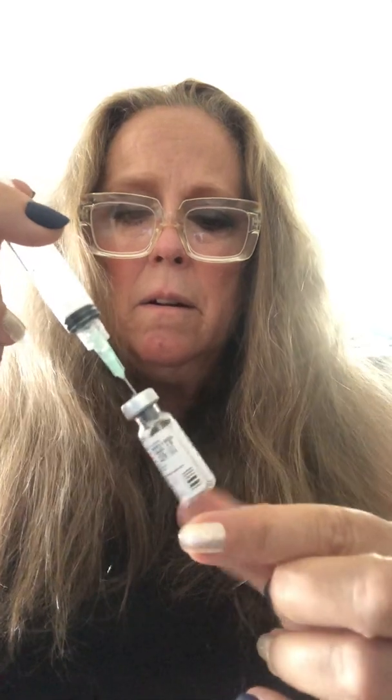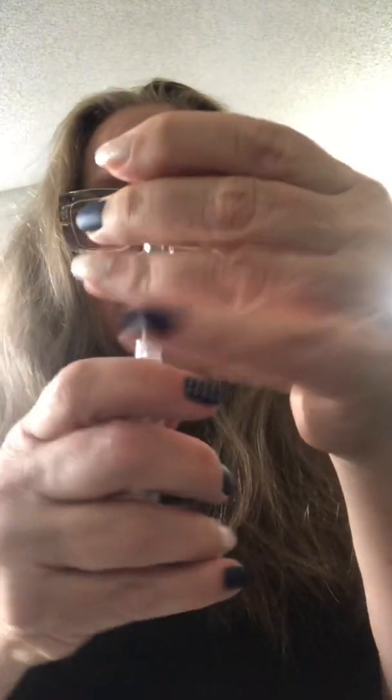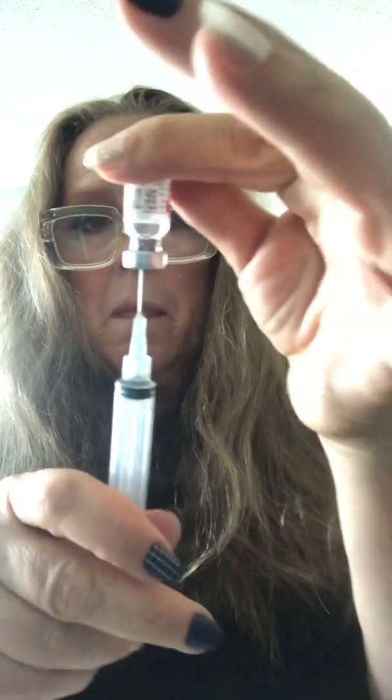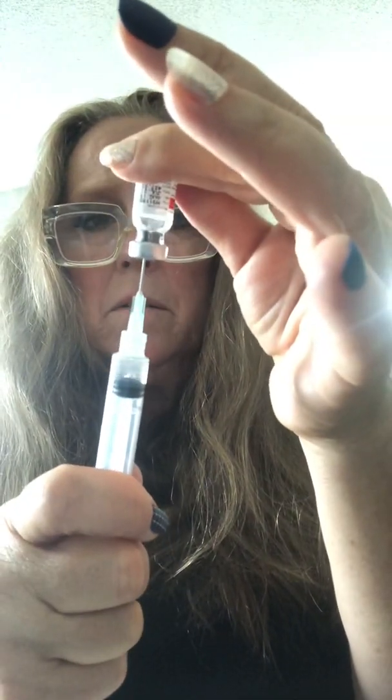Put it back into the HCG, push it in, swirl it around a little bit to get the last of the HCG out. Pull your needle tip down so you can see it in that little gap and pull out the mixed HCG and bacteriostatic water. Whoops, I didn't have my needle in — okay.